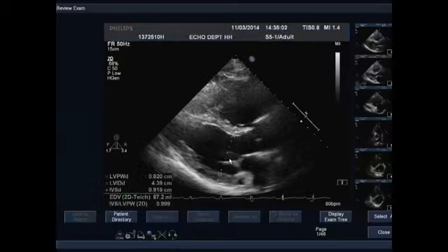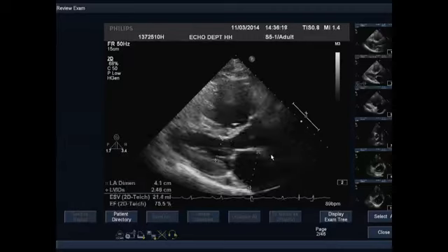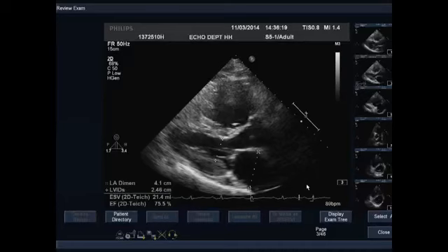It is important when we assess the dimensions of the ventricle to know that we should not include the moderator band. The moderator band is a muscle which transverses the right ventricle close to the apex, and it is hypertrophied in patients with pulmonary hypertension. Furthermore, due to the pressure overload of the right ventricle onto the left ventricle, the size of the left ventricle will be reduced. It is important from the same view to assess also the size of the left atrium, and as we know, the gold standard for the left atrial assessment is left atrial volume.